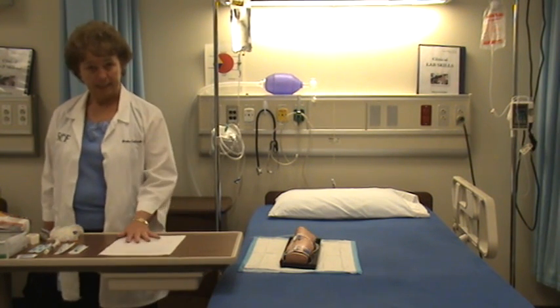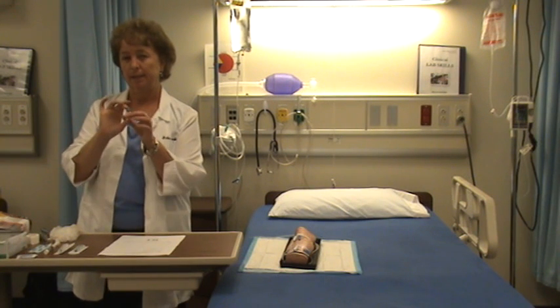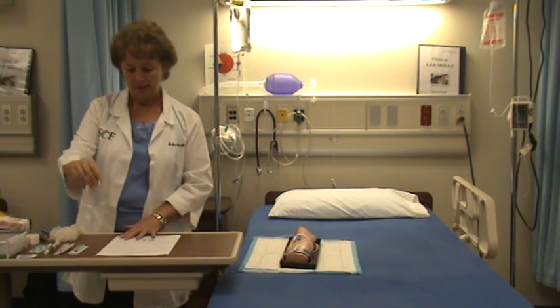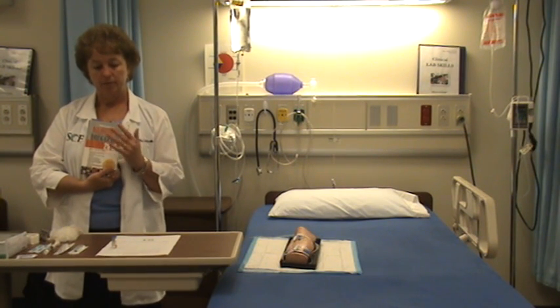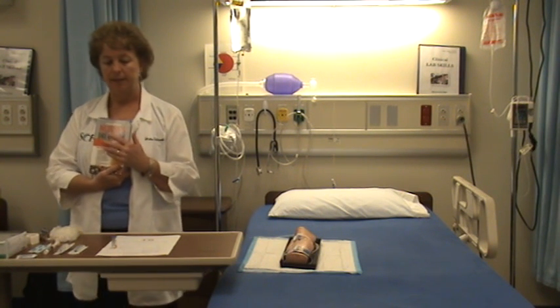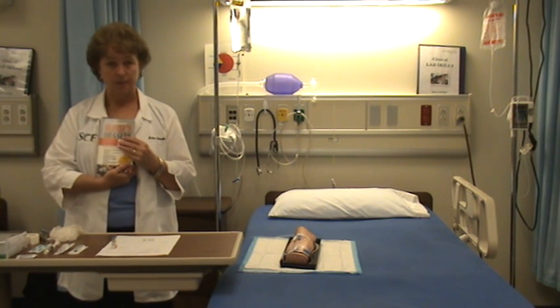I'm in the medication room and I pull out my Lasix 20 milligrams IV push. It's in a two milliliter vial and I'm going to give the complete two milliliters. I do my drug check against the MAR to make sure I'm correct — 20 milligrams — and then I've looked up the drug in my drug guide. Lasix is a diuretic, and I need to do a pre-assessment.